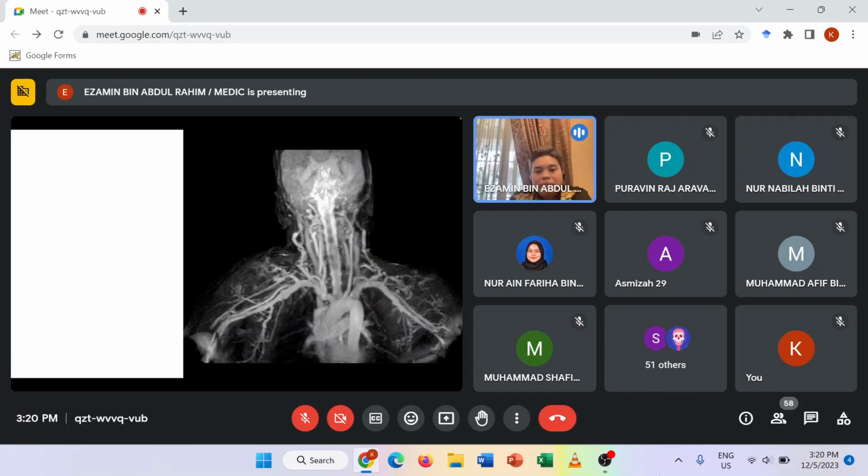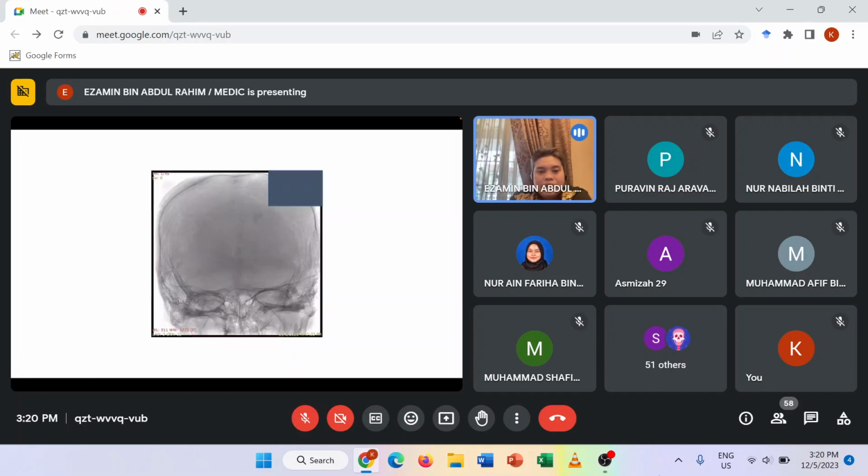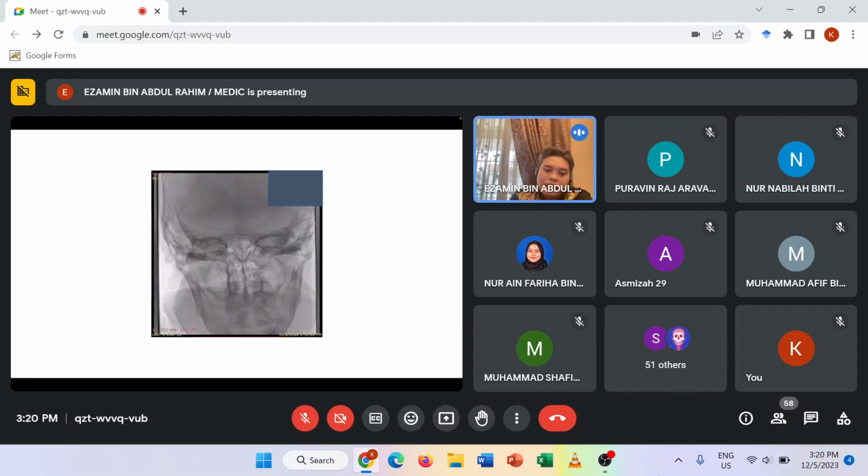So this is another picture. This is the angiogram. Our catheter is at the bottom, you don't see it. So we are about to pre-plan where exactly to go. Okay, you start to see that. You don't see the M1 just now, just like our MRI earlier. And then this one is already there.